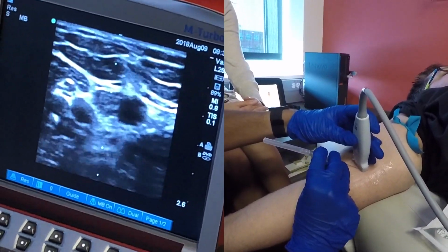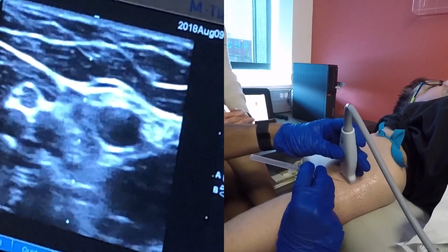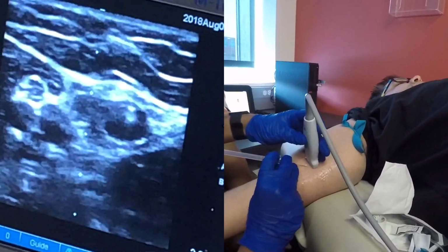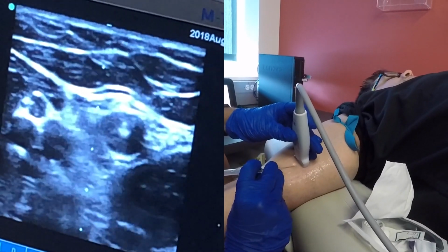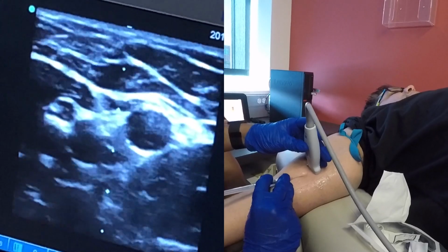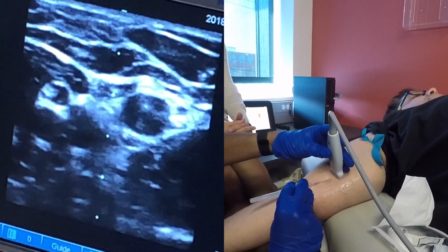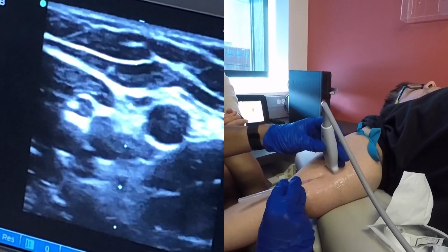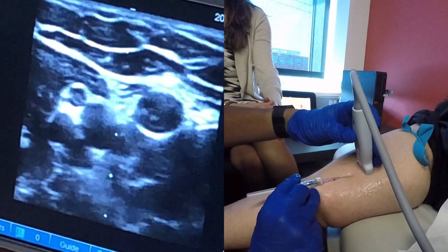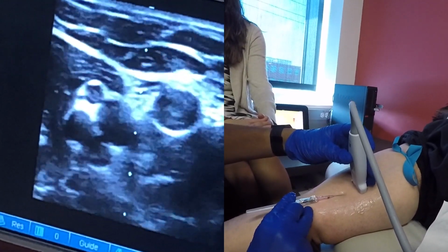All right, so now you see right there, you see where it's bouncing right over the vessel, its vessel wall itself. So now as we advance, we will enter the vessel right there. Pops into the vessel. Now you'll start shallowing out your angle. So then the best way to do this when you first start out is just to walk it in the entire way. That means I'm scanning forward with my left hand, losing sight of the ultrasound, losing sight of the needle tip, and then I'm advancing my needle tip again, scanning forward, and continuing until we are essentially hugged.